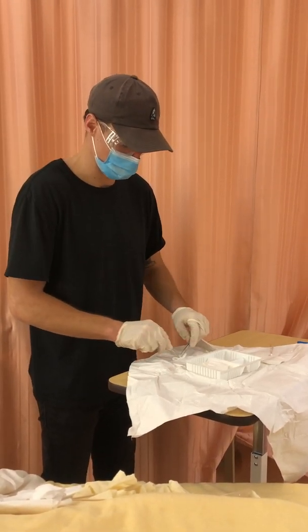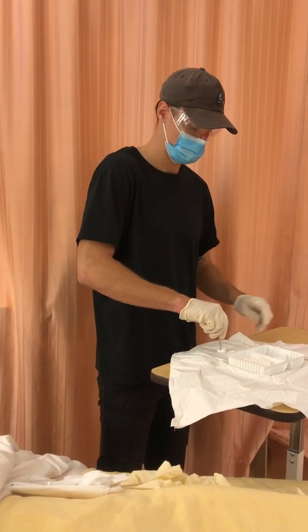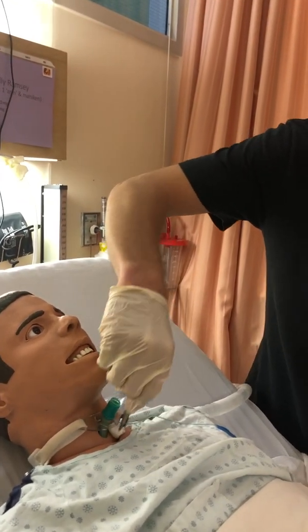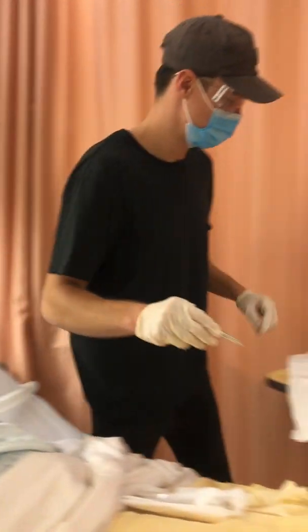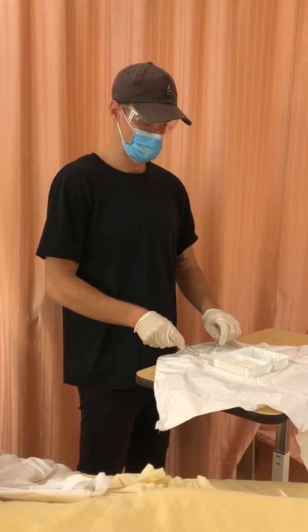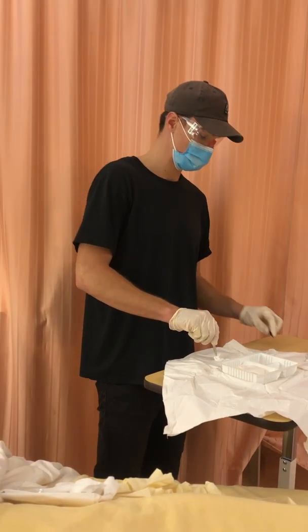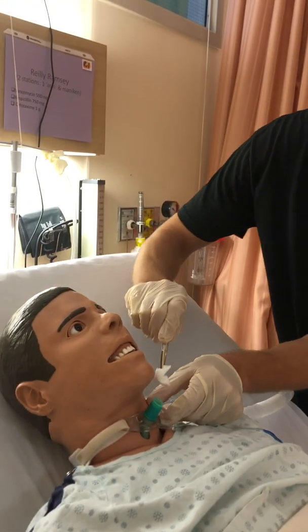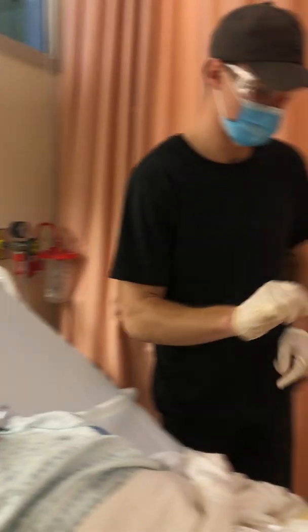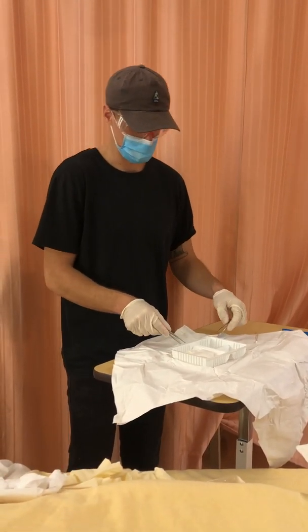So again, 2x2. One swipe on the bottom there. Oop. Take that with me. Second one here. Clean the top or dry the top. Open this up a little bit. Dry the top. And then I'd be able to put my drain tube dressing on.